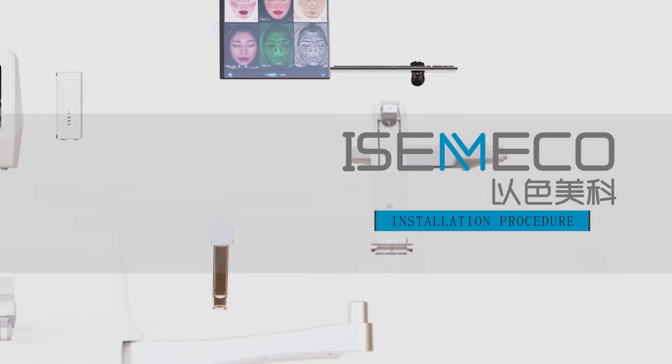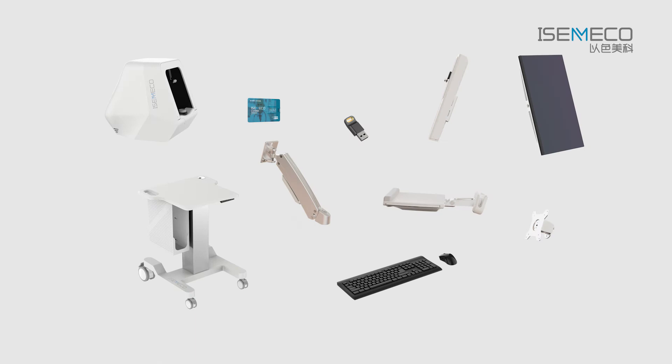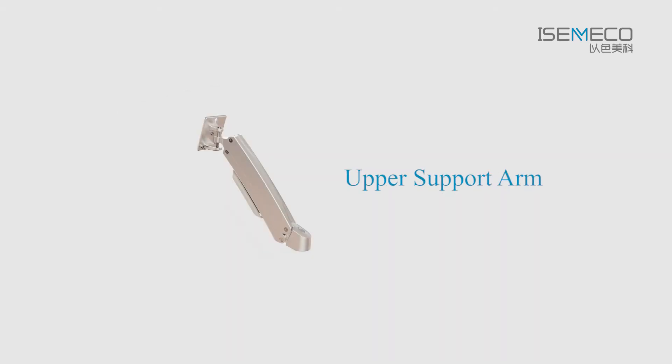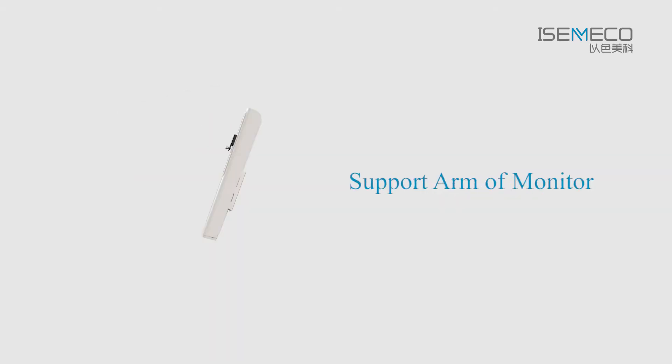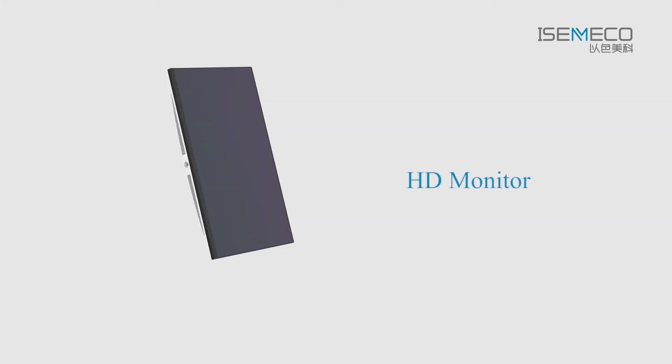Izameco Skin Analyzer Machine Installation Procedure. Take out the following parts in sequence: Electric Adjustable Operating Platform, Upper Support Arm, Keyboard Tray, Support Arm of Monitor, Hanging Bracket of Monitor, HD Monitor, Computer.